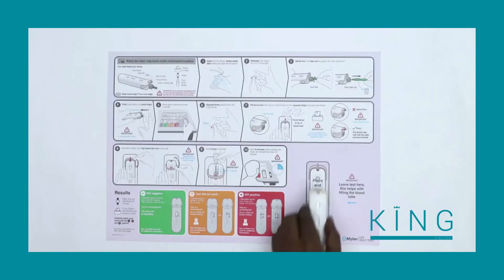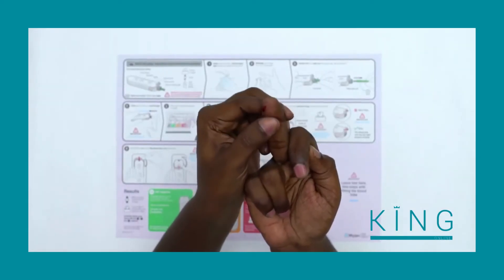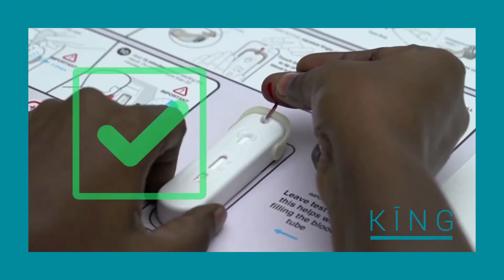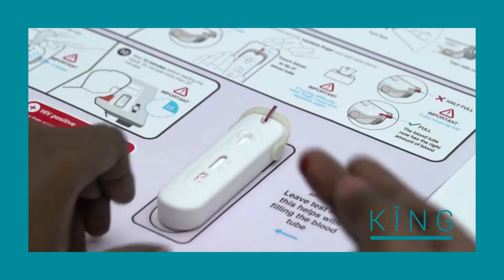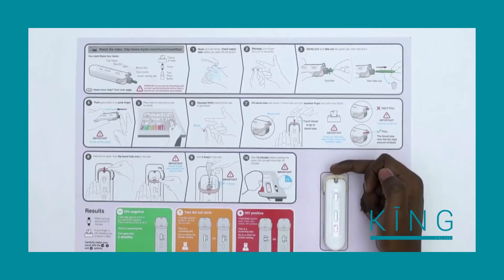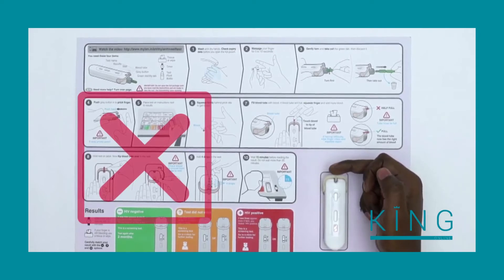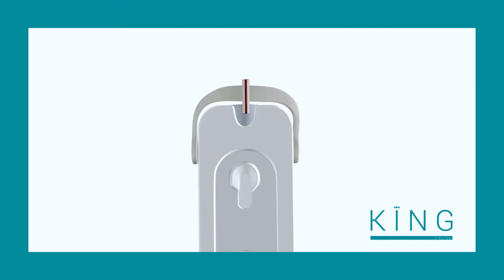Place the test down on the instructions sheet in the bottom right corner — this will make it easier to fill the tube with blood. Squeeze firmly behind the prick site on the finger. For the next step, the test should stay on the table. Hold your finger in a downward position and gently touch the blood to the tip of the tube so that it fills with blood. Avoid touching the tube with your skin. If there is enough blood on your finger, the blood will be drawn into the tube automatically.